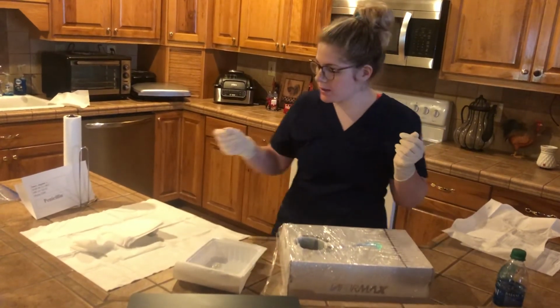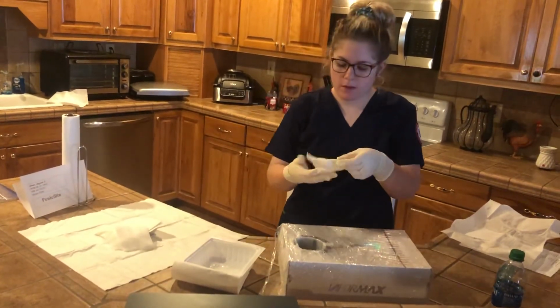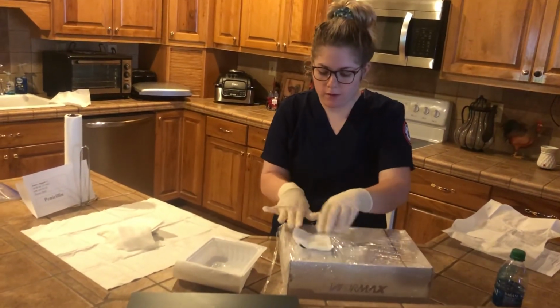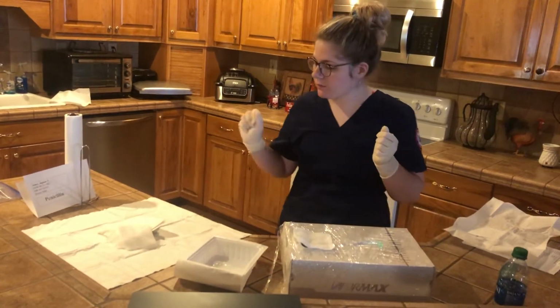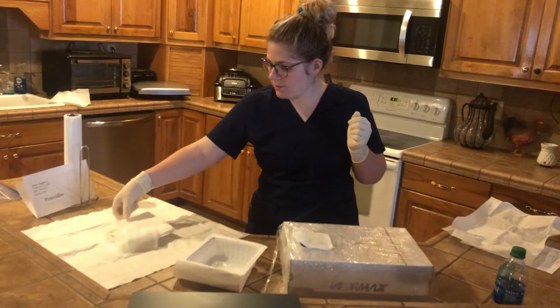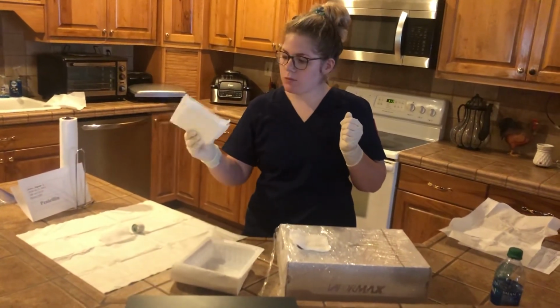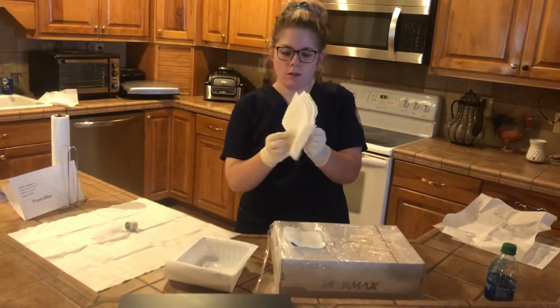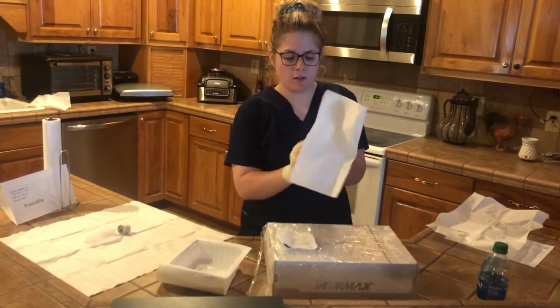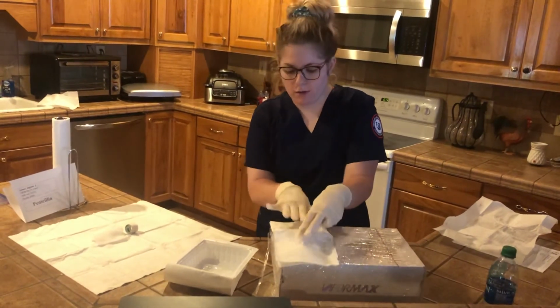And now I will get a dry gauze and place it over my dressing. I will get my ABD pad, which I am using a paper towel as. Be careful to only touch the outer portion of it, unfold it, and place it over the dressing.